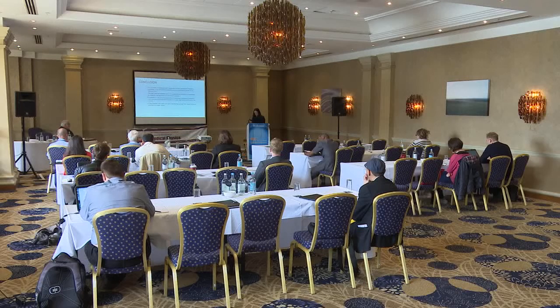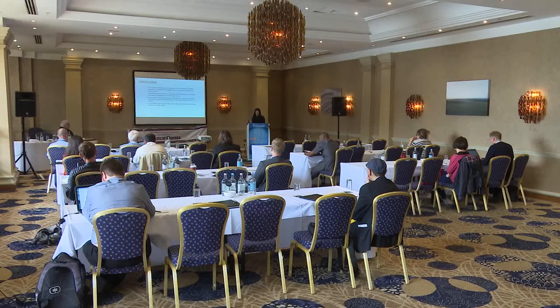Moreover, DRLs help to identify the fluoroscopy equipment, protocols, and practices that may be delivering unusually high radiation doses to the patient. If the national DRLs do not exist, setting up local DRLs based on own local practice is a viable option.